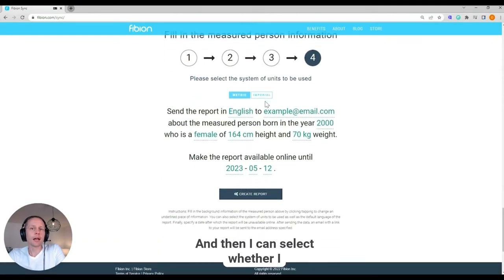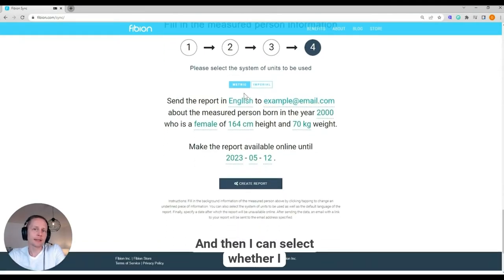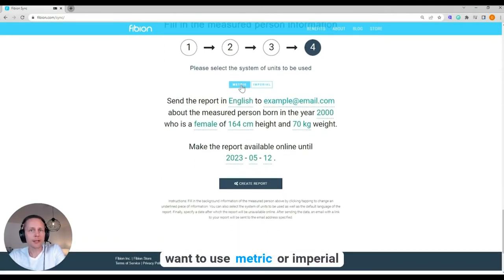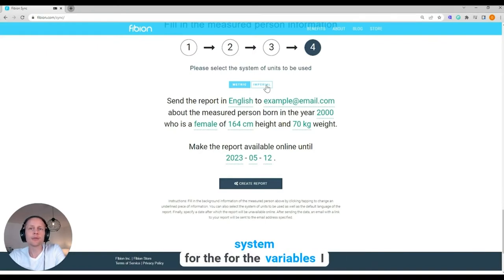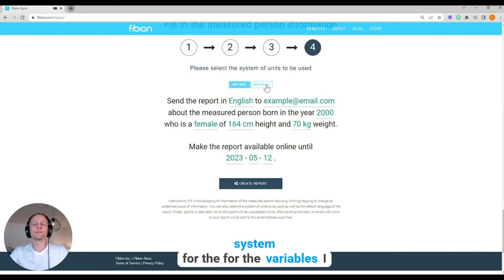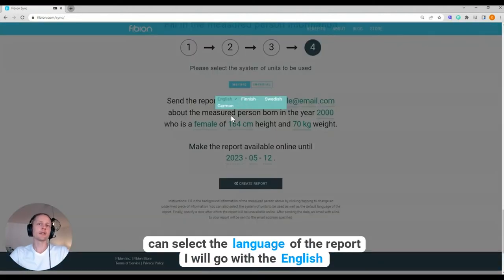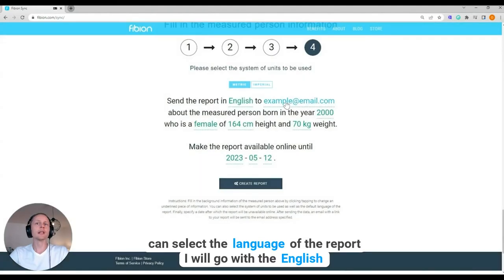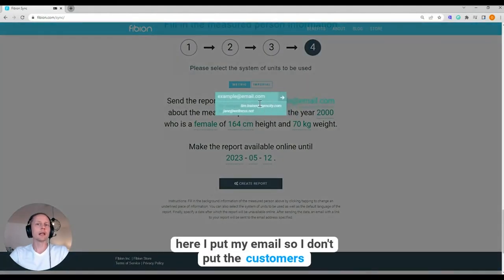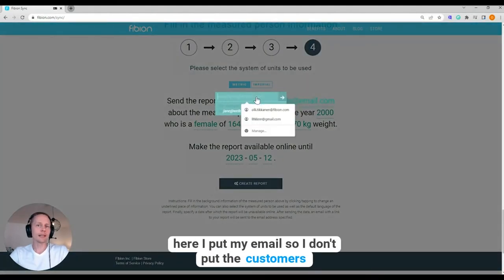And then I can select whether I want to use metric or imperial system for the variables. I can select the language of the report. I will go with English. Here I put my email.